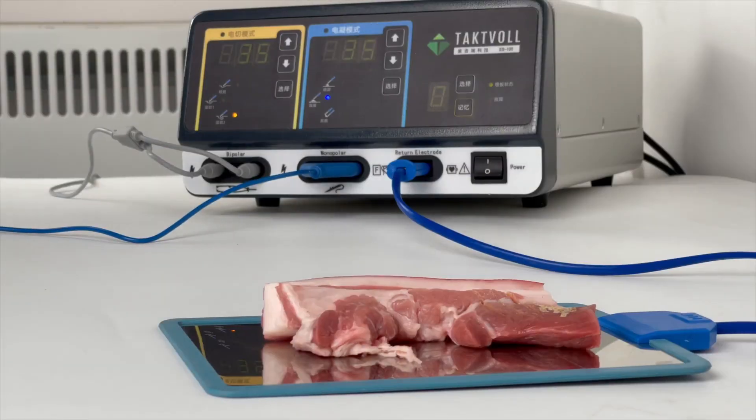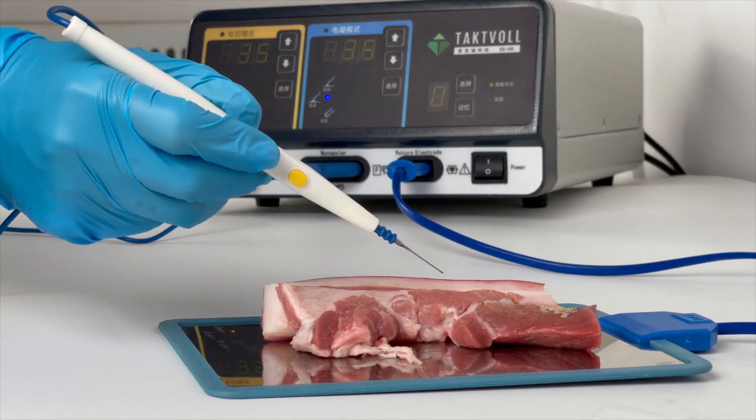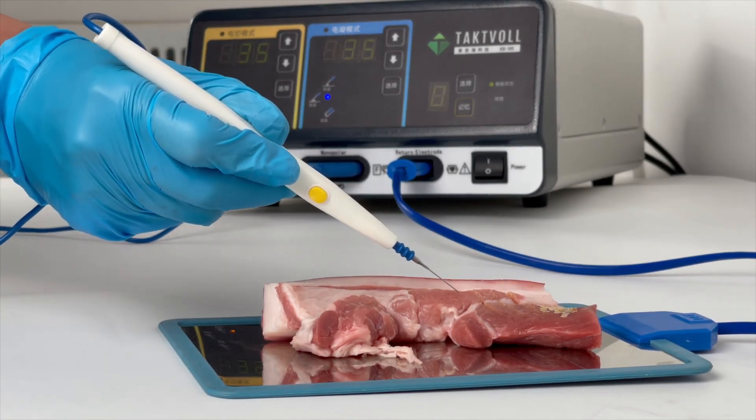For the Force Coagulation Mode, the power is still set to 35. This mode is used for coagulation at large bleeding points.